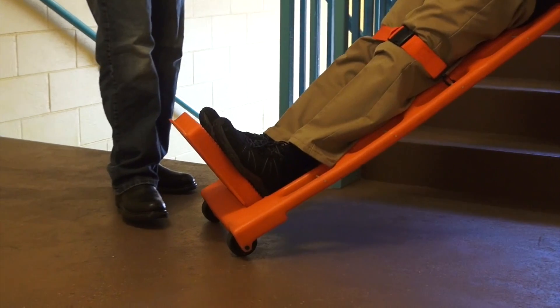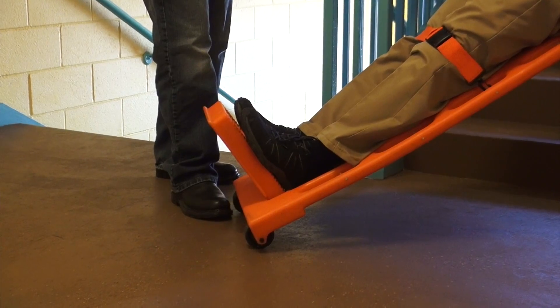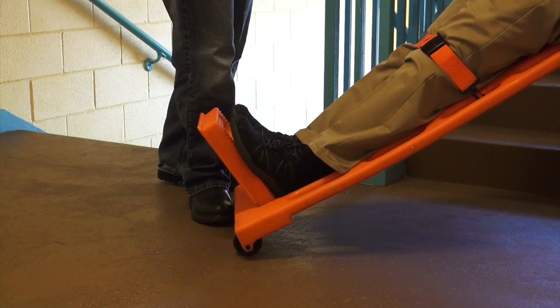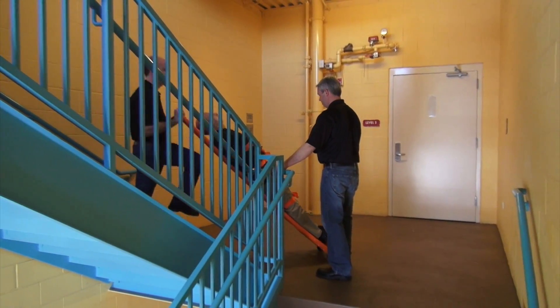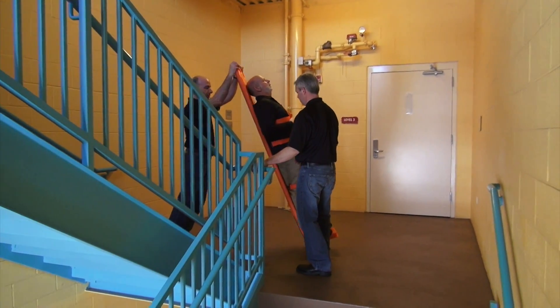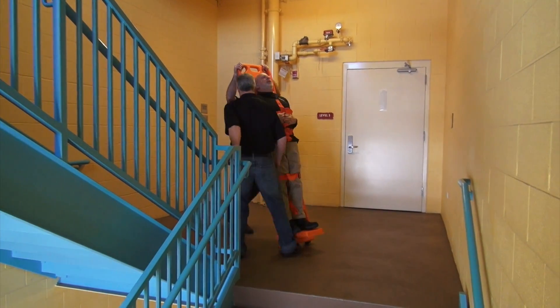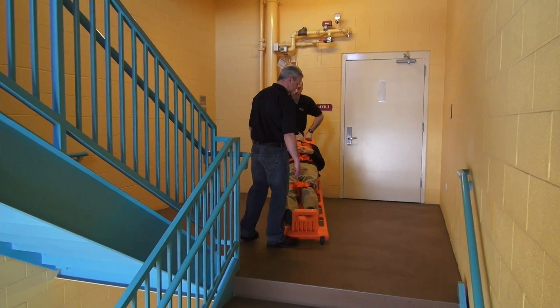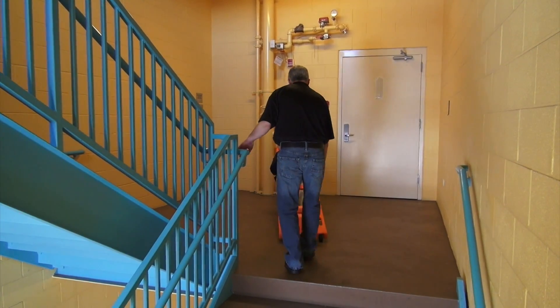One paramedic places their foot at the base of the walkboard, blocking the path of a wheel and creating a pivot point. The second paramedic lifts the patient to an upright position and then turns the patient. When the patient is facing the intended direction, the board is lowered and the first paramedic removes their foot from the base of the walkboard.